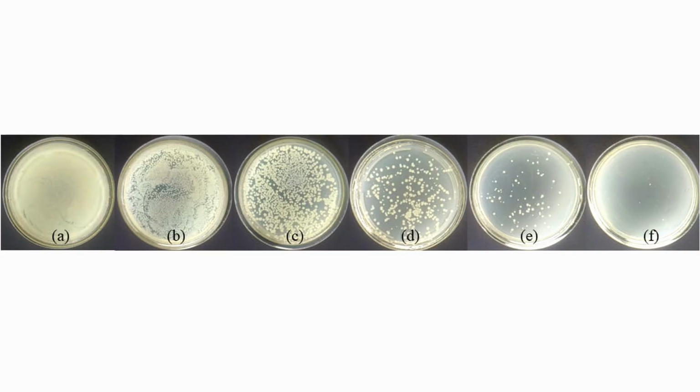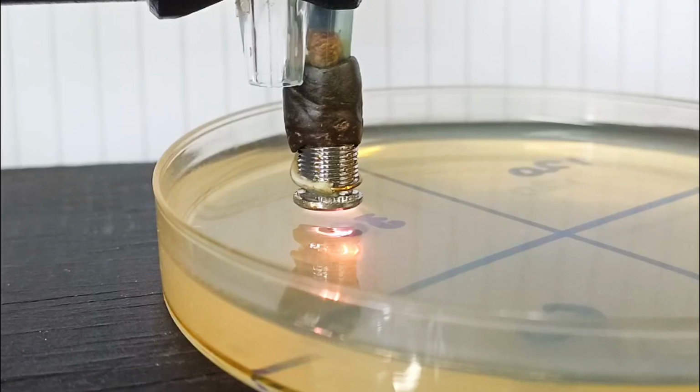The bacterial deactivation experiments were successfully accomplished, proving that the LTP generator can be used in therapeutic treatments. The dimensions of the proposed device were established, taking into consideration its possible applications like minimally invasive surgeries.